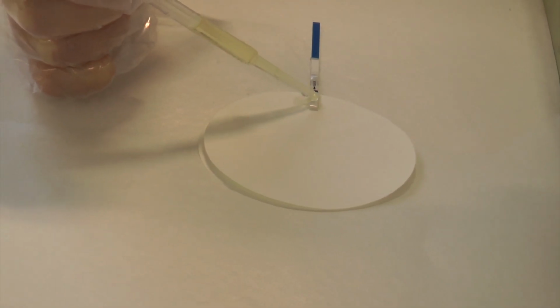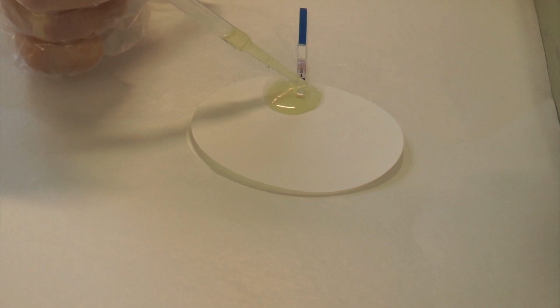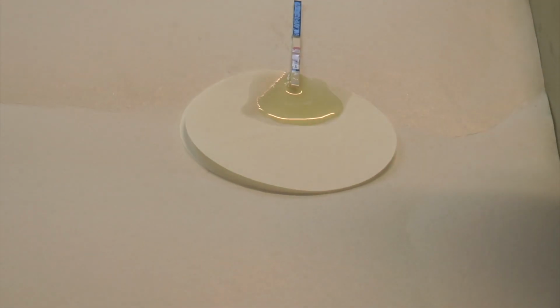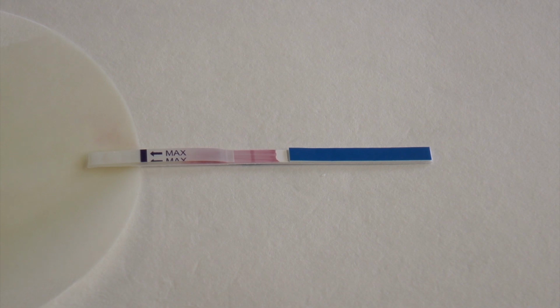So we can also see the same thing happening in the video where we're actually applying a sample to the lateral flow test, and in this first video we have a positive sample that contains the HCG, and we can see the colour move along. That's the coloured antibodies being moved along by capillary action. Once the sample reaches the coloured antibodies, not only is the liquid moving those antibodies along, but also the HCG is binding to those antibodies.